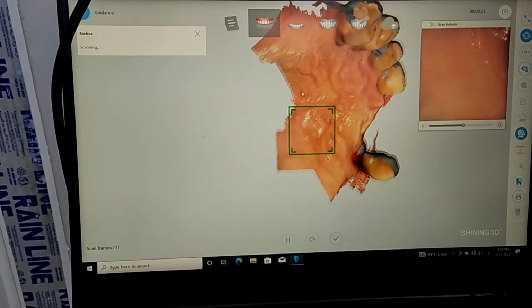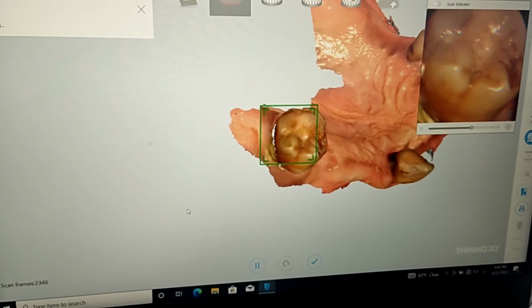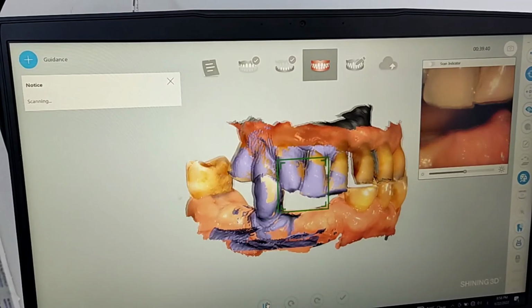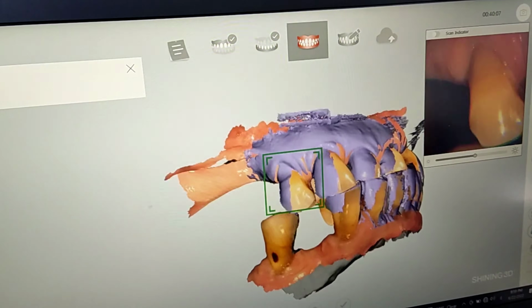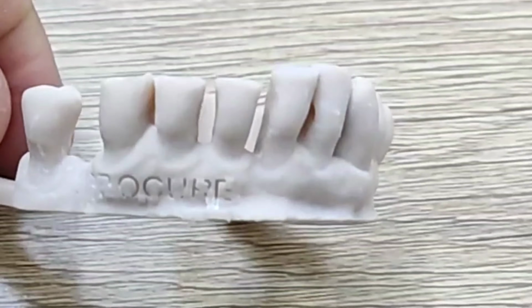This clinical case reported that a patient attended the dental clinic for artificial replacement of numerous missing maxillary teeth. He could not tolerate impression materials and dental tray because of severe vomiting reflex. In this case, the treatment plan chosen was to use an intraoral scanner and computer-aided design software to fabricate an acrylic removable partial denture.